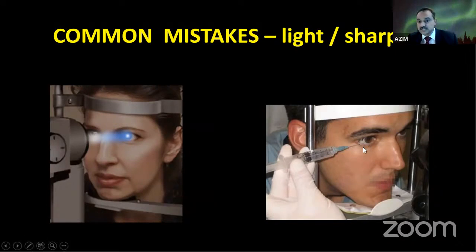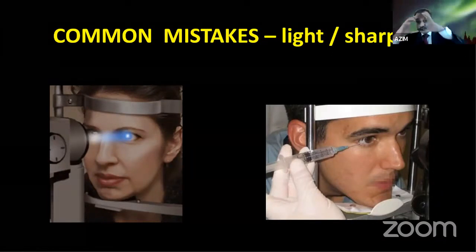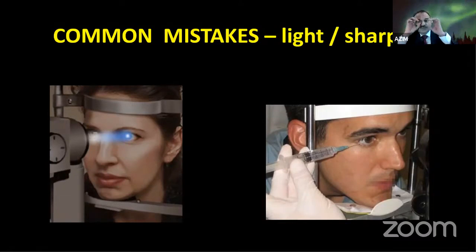When you're doing procedures, another tip. Sometimes when you go close, it's difficult to gauge 3D. So what do you do? Sit from the side, view the slit lamp, and just move the slit lamp close to the patient, about 1 inch away. Then you start focusing. It's like a camera with a huge zoom lens. You cannot do fine focusing all the way from far away. You do the main focus, then the fine focus. You move the slit lamp, see from the side, go close to the patient. Patients also trust you. Then you go to the ocular, and you move side to side, very comfortably.